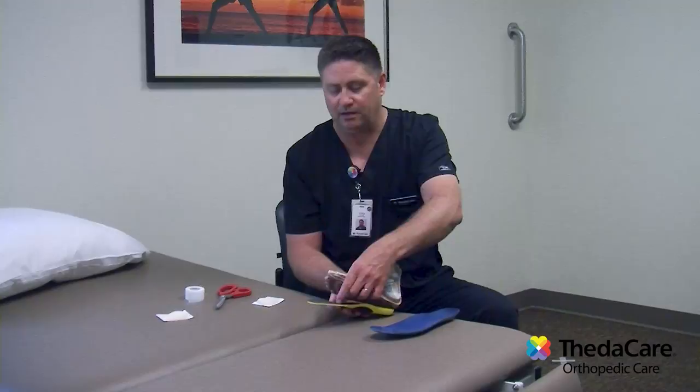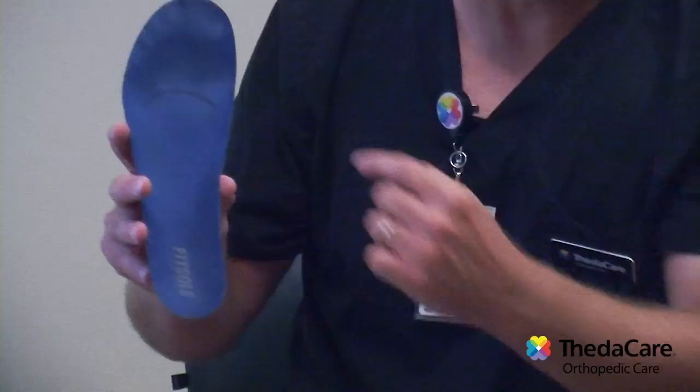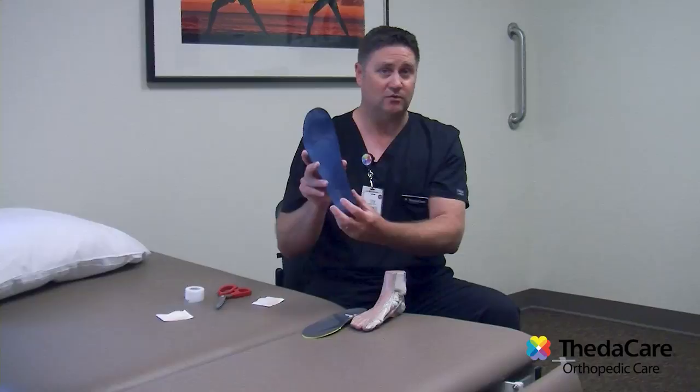This insole has been worn a little bit, and if you have a pair of shoes that you've worn a bit, you can see a wear pattern — I've highlighted it with a black line there — where your metatarsal heads hit. The placement of the pad should be just to the heel side of that line, and I will show you how to do that quickly today.